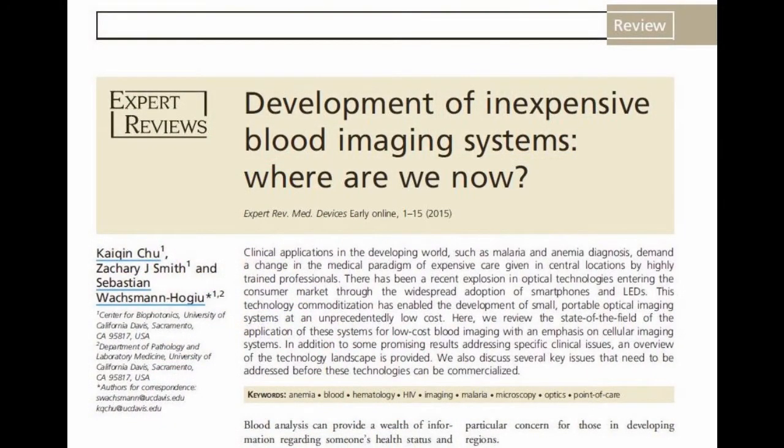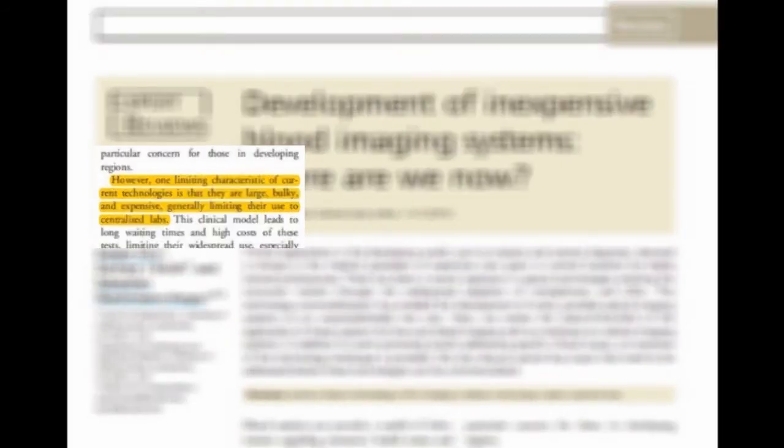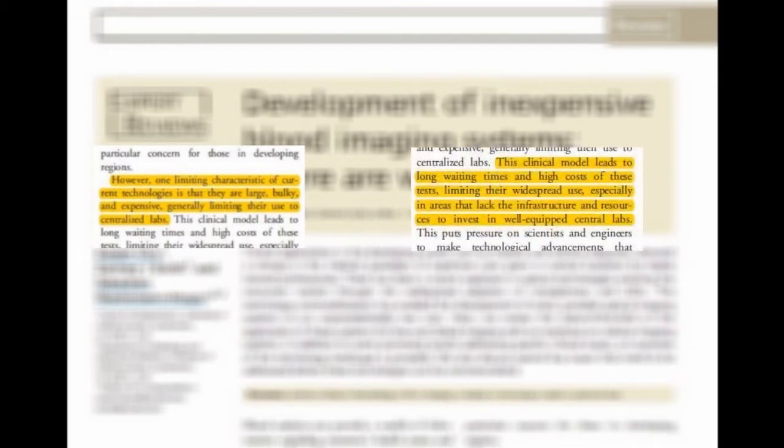According to the expert review, "Development of inexpensive blood imaging systems: where are we now?", it states that one limiting characteristic of current technologies is that they are large, bulky, and expensive, generally limiting their use to centralized labs. This clinical model leads to long waiting times and high costs of these tests, limiting their widespread use, especially in areas that lack the infrastructure and resources to invest in well-equipped central labs.